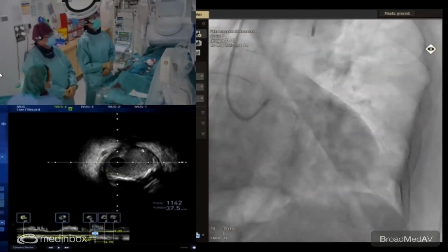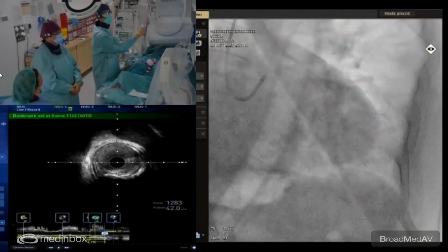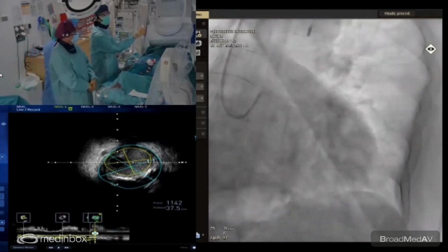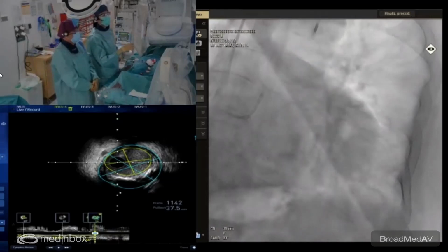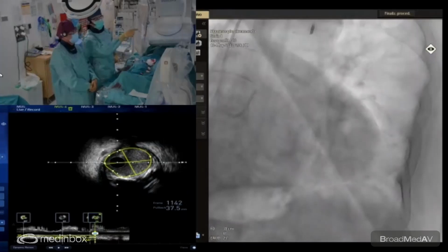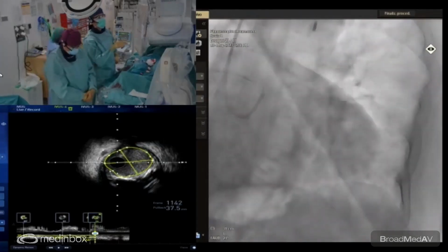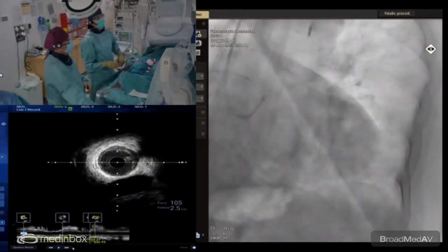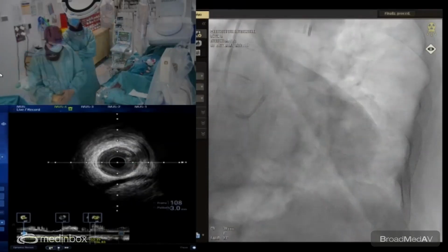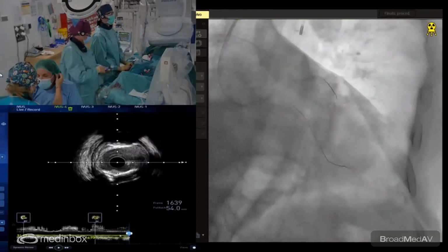We have some debate here because in the previous angio, the length is, in my opinion, near 30 or 30 something. Yeah, and the initial IVUS measurement said that it was nearly 50. 2.5, 38, 48. 38 quizá, ¿no? 38 yo creo. And the distal bookmark, please, just to check. Can we have a Synergy stent 2.25, 38? Probably there. Okay, it's close. Let's implant here.